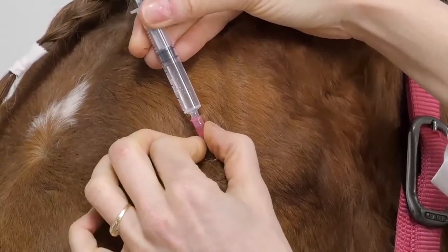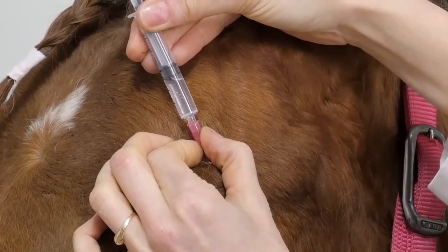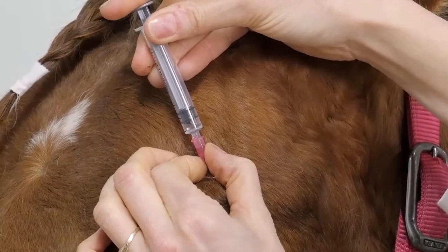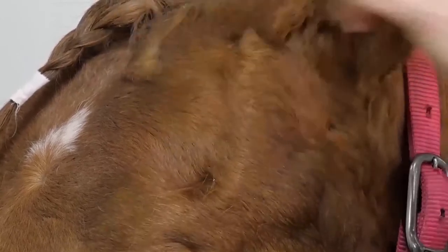Be careful when infiltrating the lidocaine for nerve blocks. Hold the syringe to the needle hub and inject slowly. The lidocaine is relatively thick, and if injected too rapidly through the small needle, the needle will detach and spray everywhere.